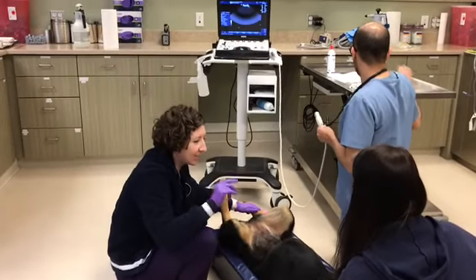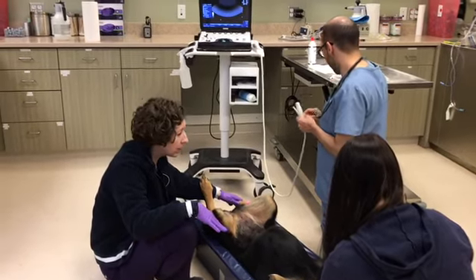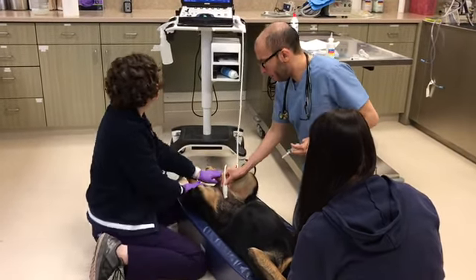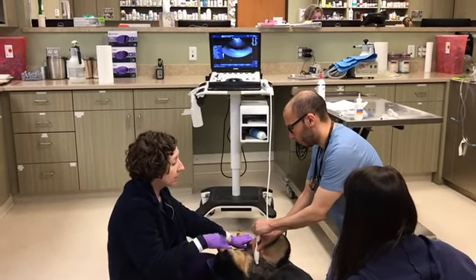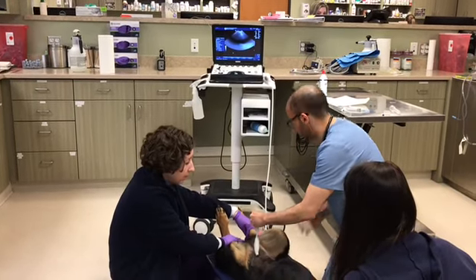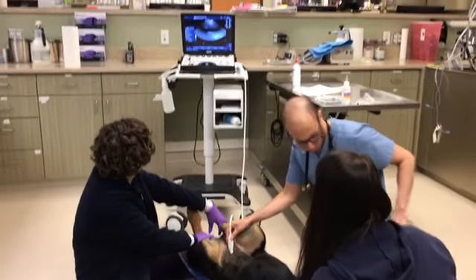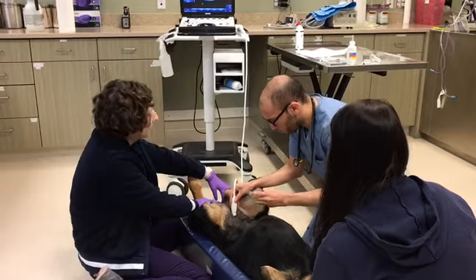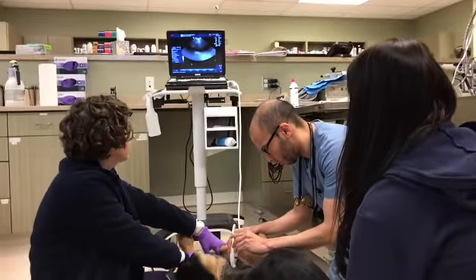Okay. Alright, so what we're going to do is do a cystocentesis on this Rottweiler. So I am helping to restrain while Dr. Patino is using the ultrasound to find the bladder. He's got a 6 ml syringe with a 1.5 inch needle. And so we put a little alcohol on the bladder, and he is using the ultrasound to locate the bladder.